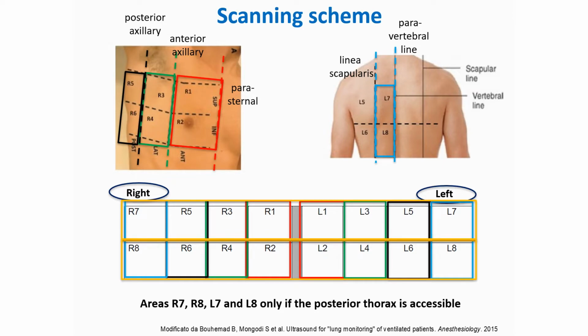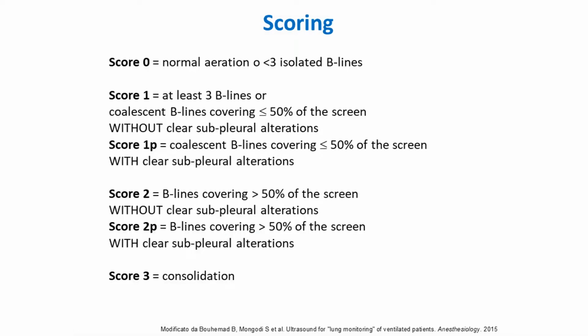This scheme and this approach have been used for quite a long time, especially in intensive care units. There are other scanning schemes or approaches that can also be useful. We chose this one because it is both comprehensive and quick. Using a standardized scanning scheme is also useful because it allows some kind of scoring.